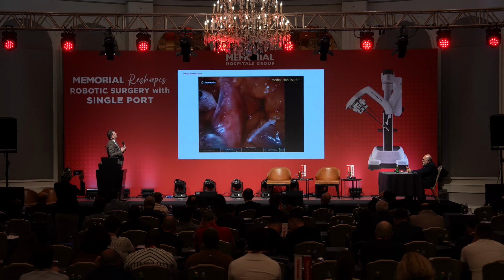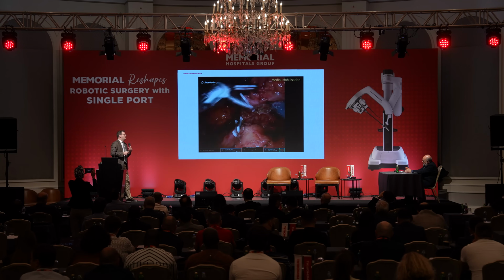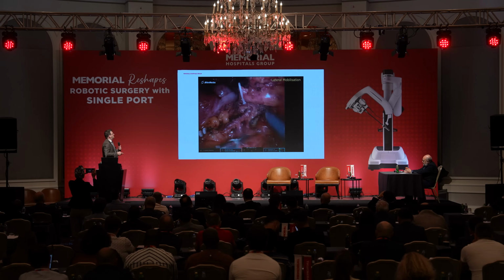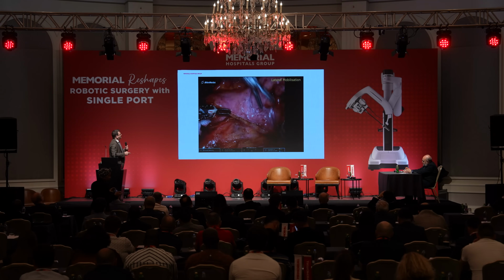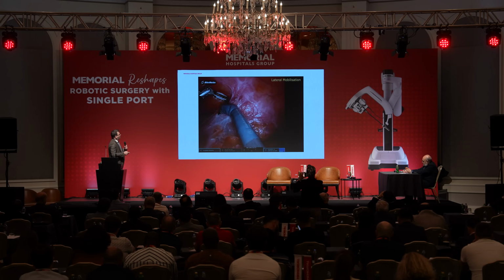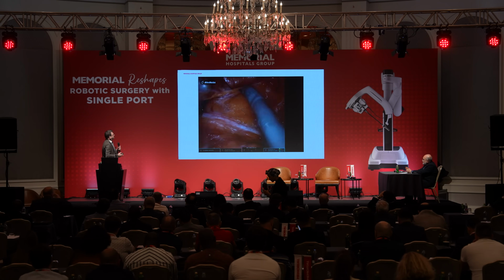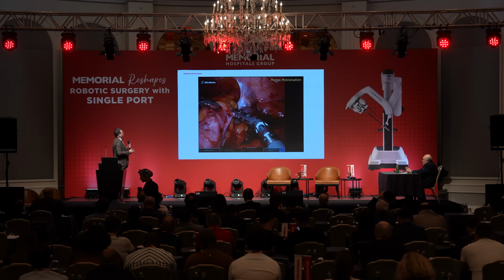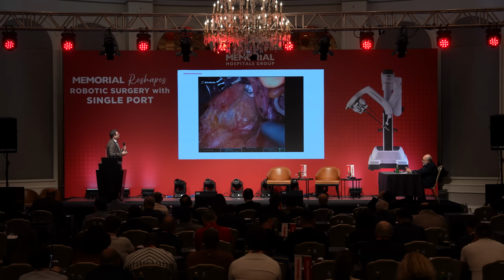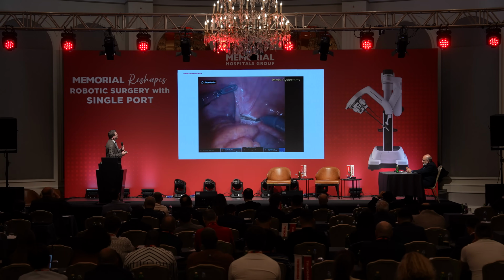You need to take the inferior mesenteric vein from below the lower margin of the pancreas, not only for oncological reasons, but also to mobilize the left colon for a proper anastomosis. So those operations sometimes also require removal of other organs, including the uterus and the ovaries, or if it is invaded by the tumor, the urinary bladder has to be removed, as you see here.